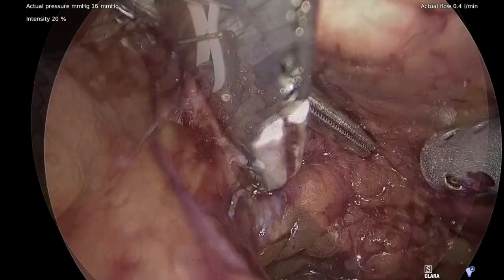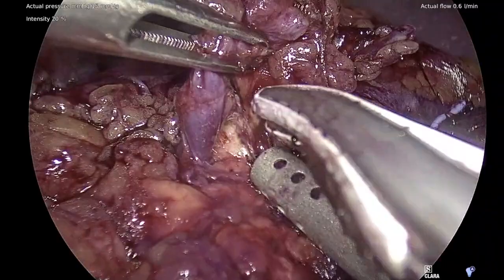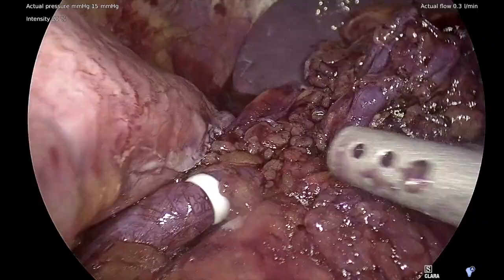In this view, the pancreas is reflected anteriorly to facilitate the posterior dissection of the proximal splenic vein. This dissection is carried out laterally to better define the distal aspect of the vein, thereby allowing us to define the course of the splenic artery and the splenic vein in relationship to the pancreas inferiorly.